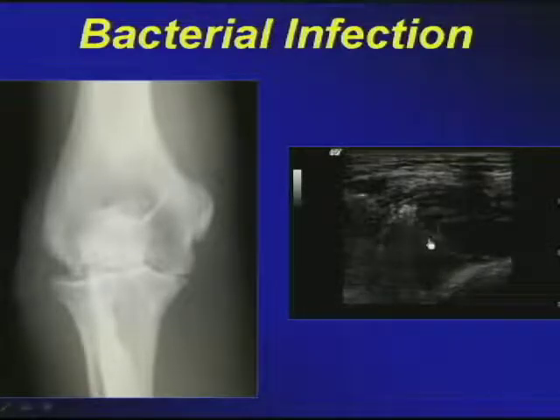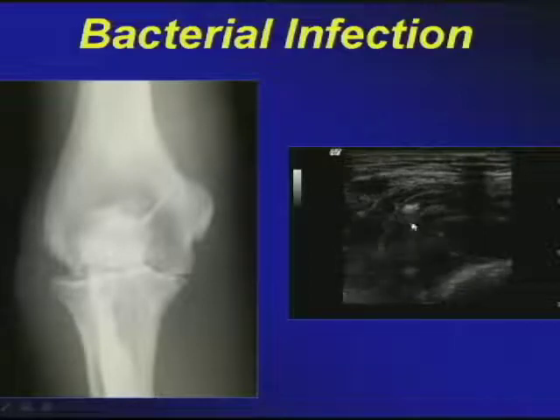Take a look at the ultrasound, which is needle guided. Here you see the shaft of the needle, the tip of the needle as we sample it. The high level echo with some reverberation artifact represents gas or possibly air introduced by the examiner as we sample this elbow. Note too that with a needle we can distinguish which one to sample, either the fluid part of it, or we could also use a true cut needle and sample the more soft tissue or mass-like appearance of the distended olecranon fossa.